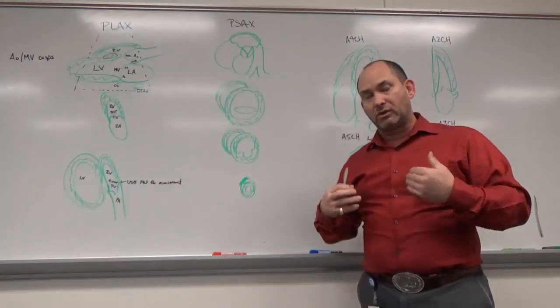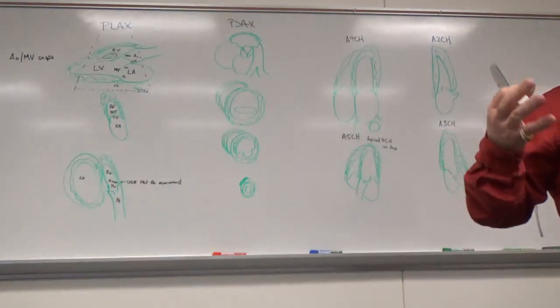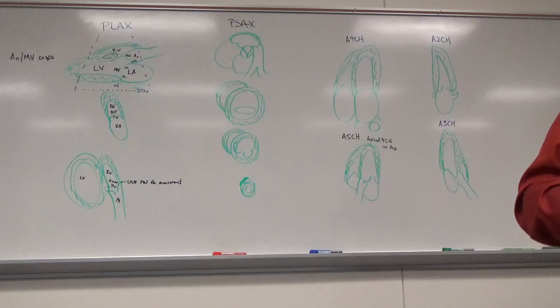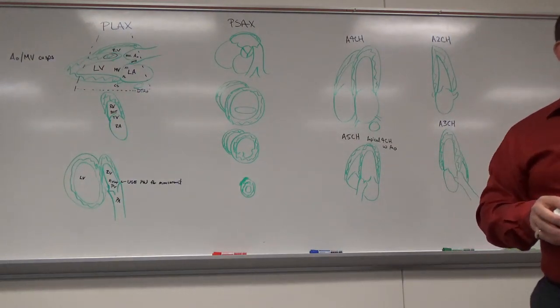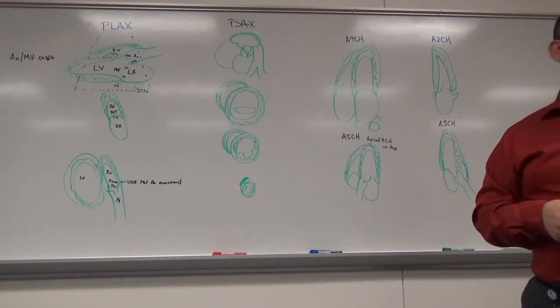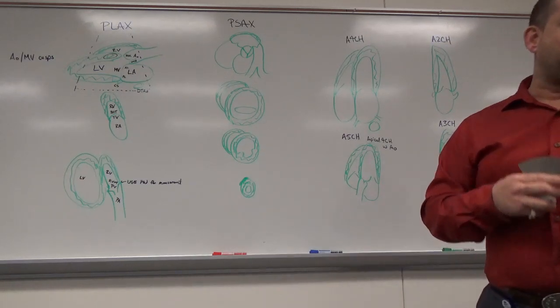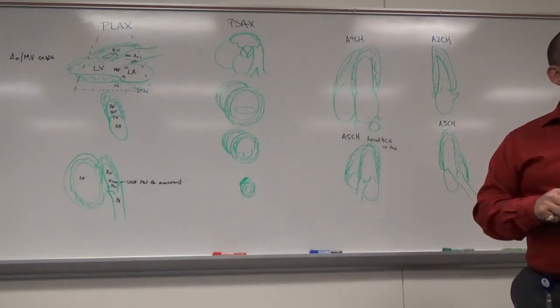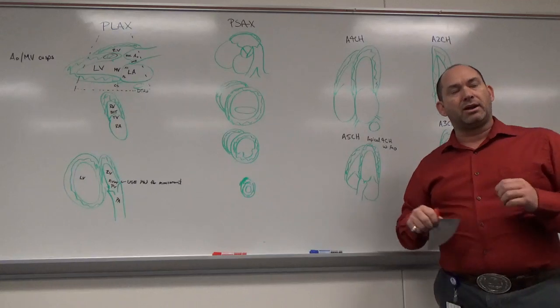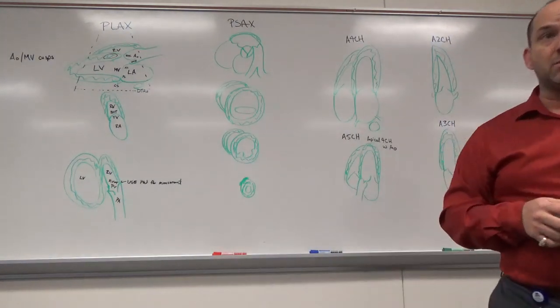So from my personal experience, I find that if patients do a breath in, not a big breath in, but just a small breath in, and then breathe it out and then hold it. And you have to tell them, hold your breath, don't breathe. Because what will happen is they'll hold their breath and they start breathing again right away. You didn't get your window. So the commands that you give the patient are very important to them complying with what you need and getting your echo into the position it needs to be.